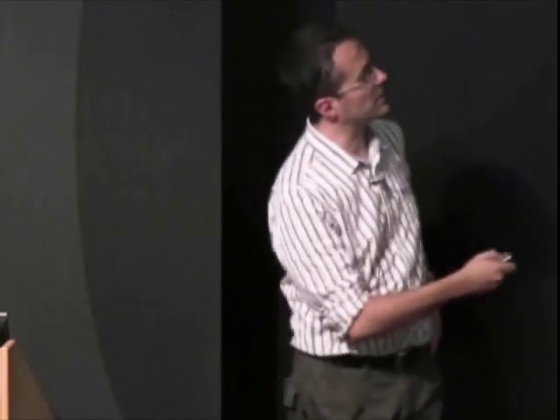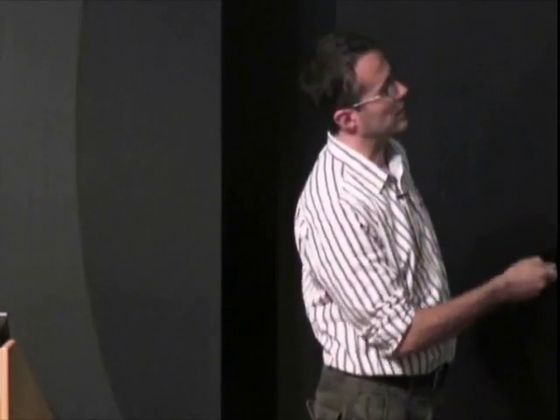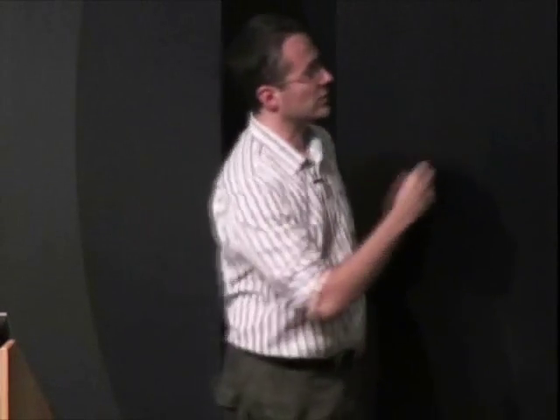So clearly, this is a difficult and very time-consuming thing to do, because for an image like this, you can immediately see roughly where the tumor is. But if I told you what is the active part, what is the necrotic part, and what is the edema, when we try to figure out pixel by pixel which one is which, is very difficult to do. So doing this efficiently, even interactively, even allowing the user to interact with the image and to put in seeds and to provide hints, this is very difficult.